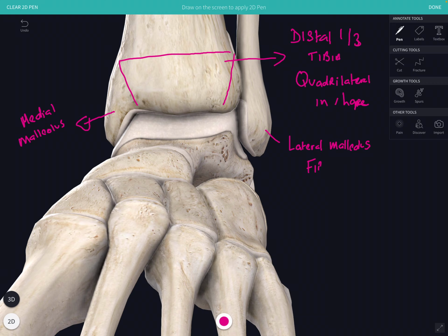of the fibula. And if you remember, when you're positioning for an ankle, palpation of the medial and the lateral malleolus becomes an important part of our technique. When we're doing an AP ankle, we rotate the ankle in slightly so that the medial and the lateral malleolus are equidistant from the digital detector or the tabletop or the CR cassette.